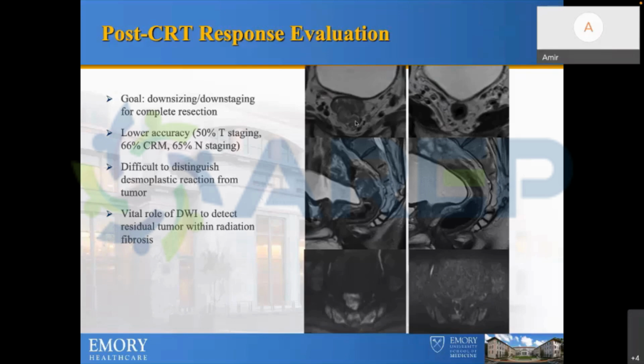But if you say T3 is now T2, you might not be accurate. You don't know if there's still tumor inside the mesorectal fat. You're just going to say it's responded based on imaging. We don't know how much tumor there is still. So you don't restage the T stage. Does it make sense?